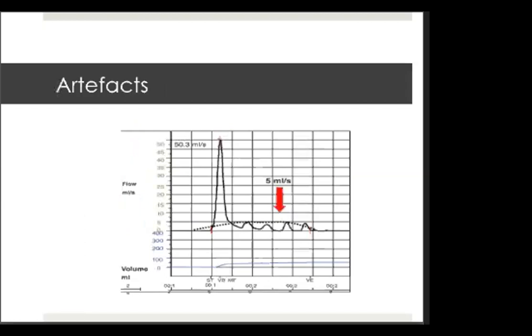So sometimes we encounter also artifacts. For example, this one. Ito yung normal pattern niya, but we can see a peak here. So, ang nangyari dito, the patient squeezes his urethra and then releases abruptly, causing a spike in the recoil of the urethra.